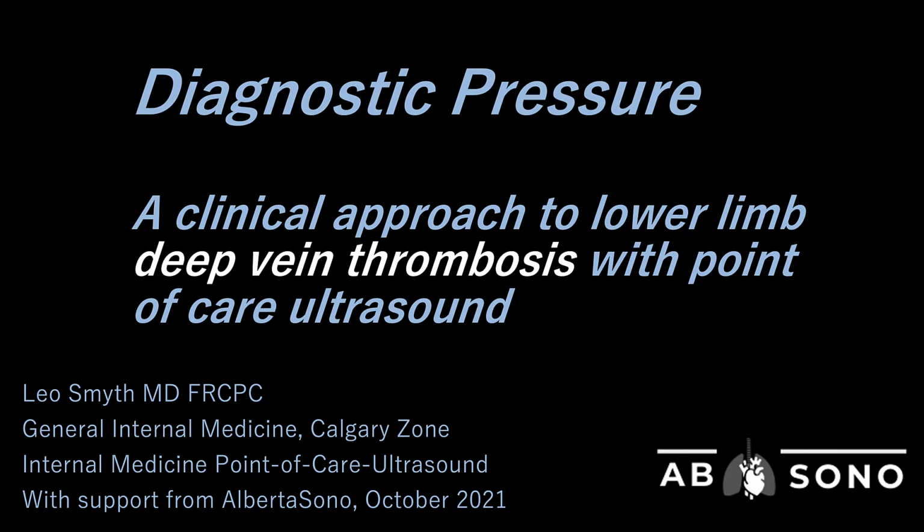I must warn you though, clinical reasoning around thrombosis can be challenging, and POCUS does not necessarily make it much easier. I'd like to thank Alberta Sono for their help with this project.